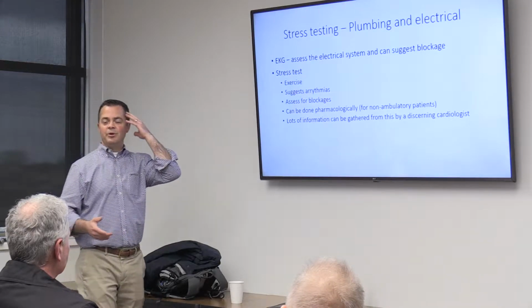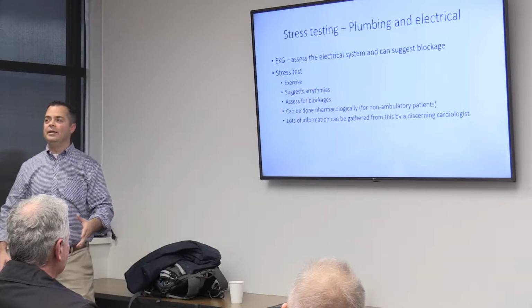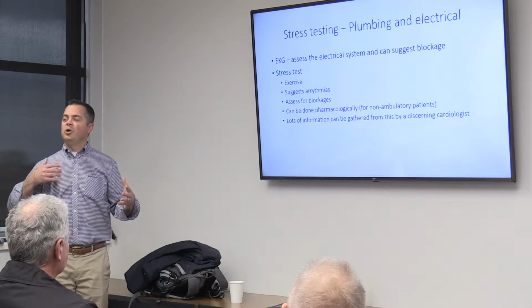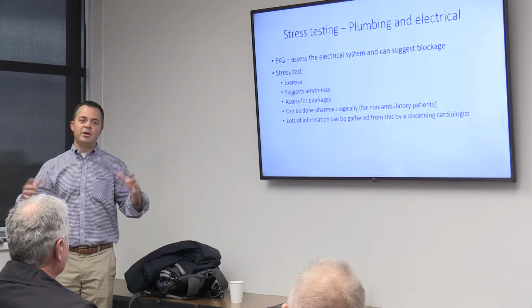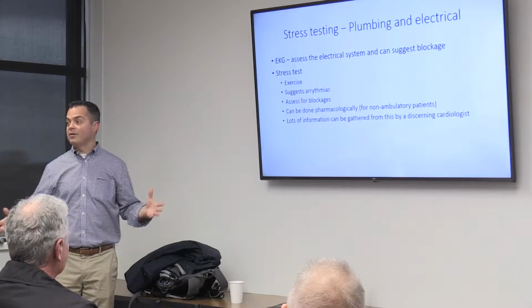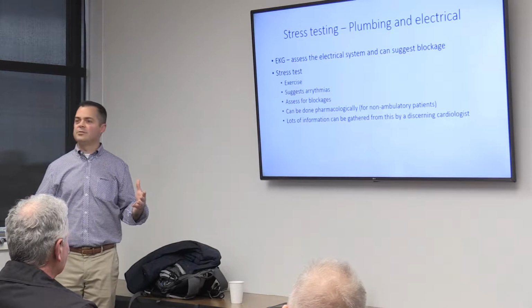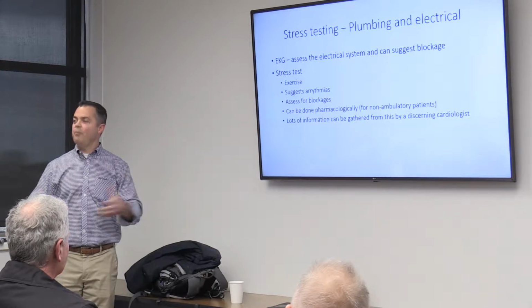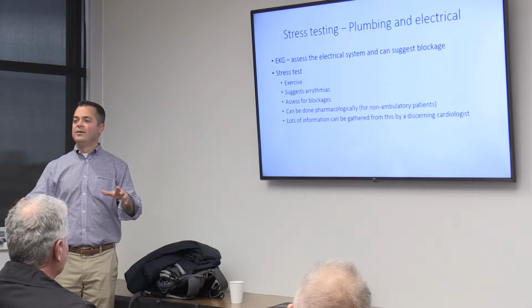Everybody has this kind of view in their head of what a stress test is, and you get on the treadmill and you go. Patients always ask me, "Well, I've always had the chemical one, so I just want to make sure I get that one again." And I'll say, well, can you walk? Can you exercise? And they'll say, yeah. And I'll say, well, why are they doing it that way? There is no chemical or pharmacologic way of mimicking or repeating exercise. We just don't have it.